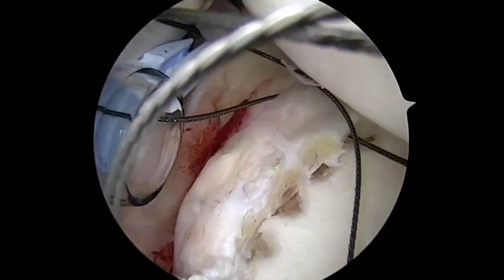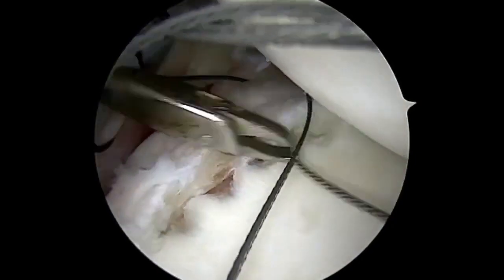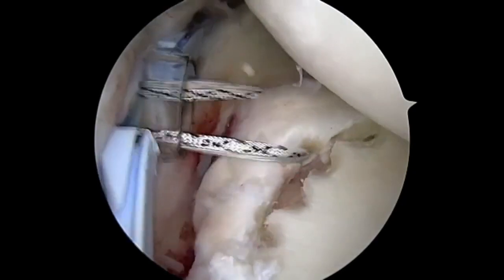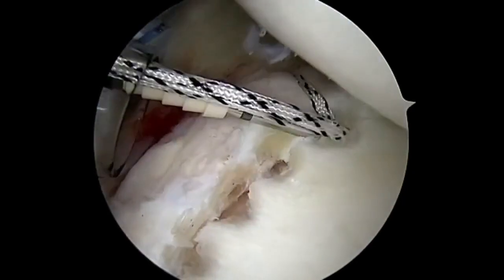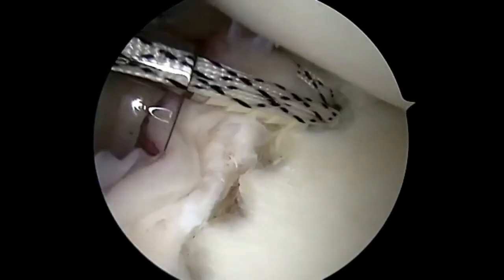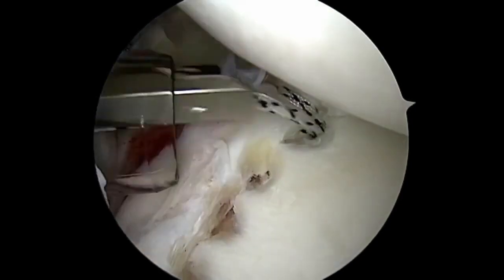We're going to shuttle the wire into the joint, remove our suture passer, and then grab the wire with a looped grasping device. The suture is then loaded into the loop of this wire and pulled back through the soft tissues. The anchor is loaded with the suture, tension is placed, and the anchor is deployed. The handle is unscrewed from the anchor and removed.